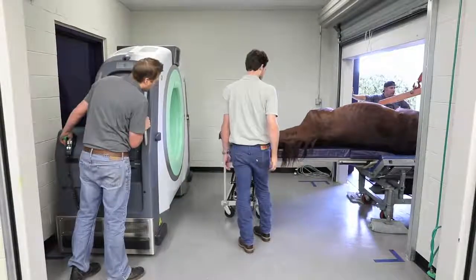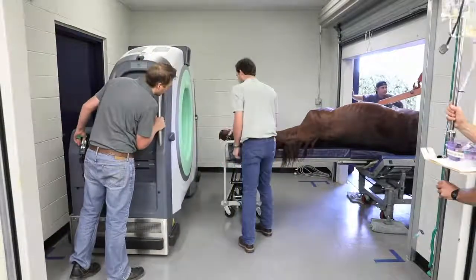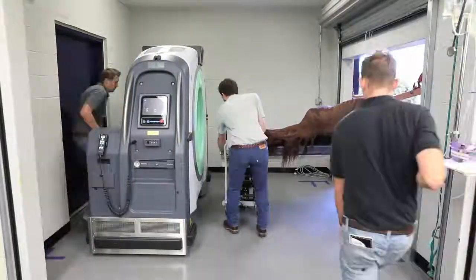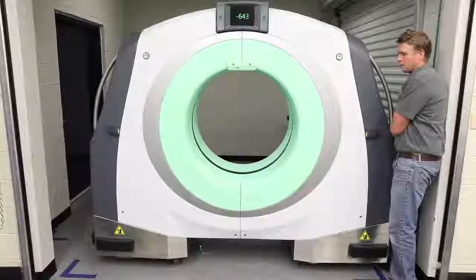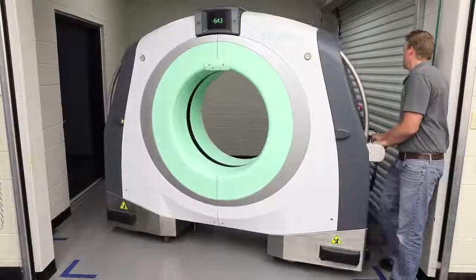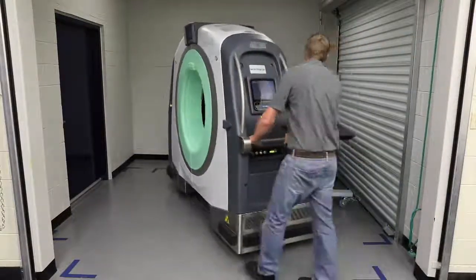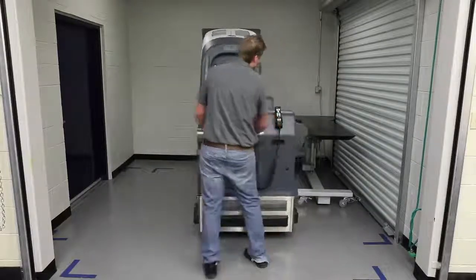It's very easy. We have it in a room where there's three different openings, and we can move the CT depending on which anatomical structure we need to scan, whether it's the head or the neck or a distal extremity. One person can manipulate it. So when it's up on its casters, the radius turn is very small, so it can pivot to swivel around. And then the driving capability when it's down on the tracks also allows great maneuverability within a small space.